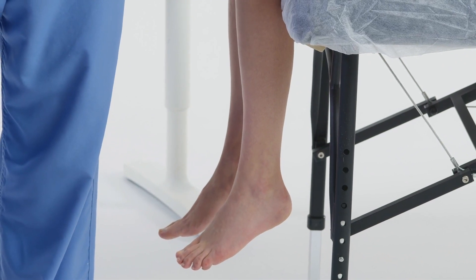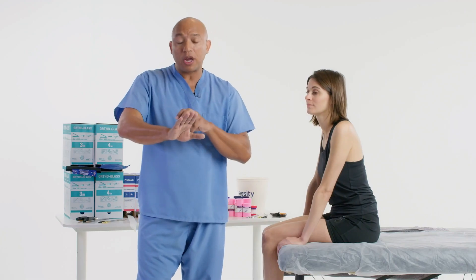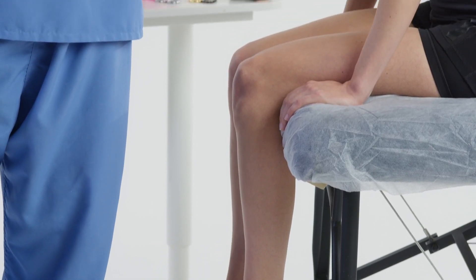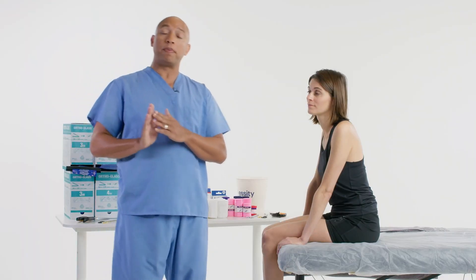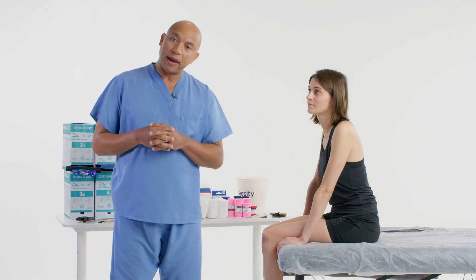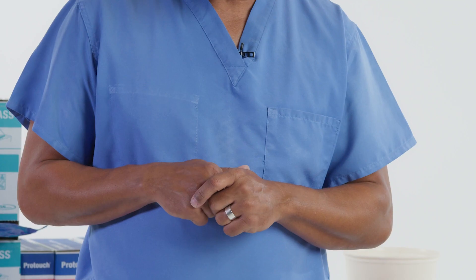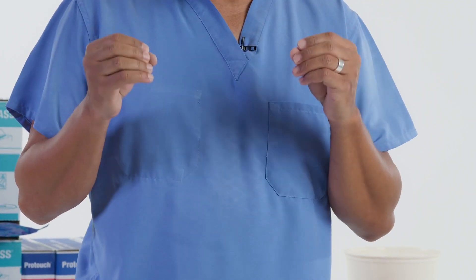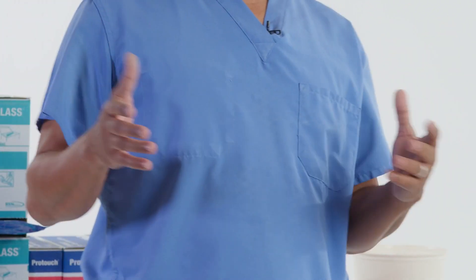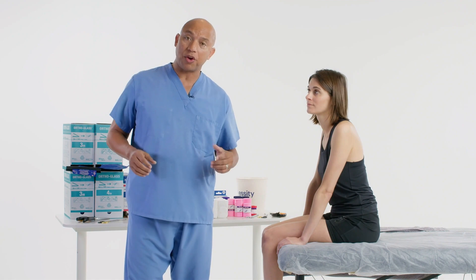The way we're going to put on the posterior slab, the injury can be up in the ankle area, it could be in the metatarsals, it can be in the phalanges or the toes portion. The goal with this is to ensure that the patient is at 90 degrees or neutral position. What's important is there are two occasions when it's not advised to put the patient at 90 degrees: when the patient has a comminuted fracture, broken in many places, or they have an Achilles rupture.